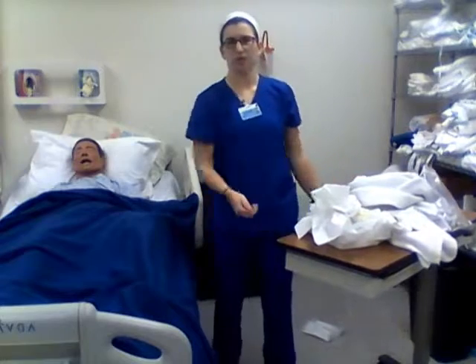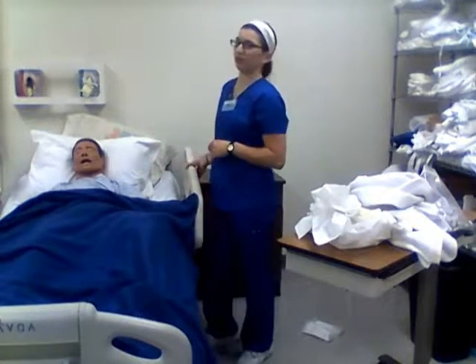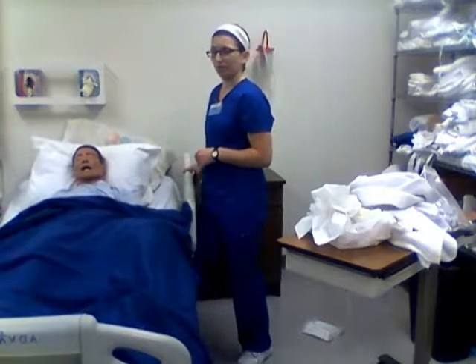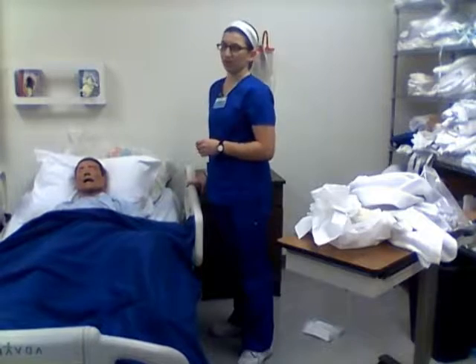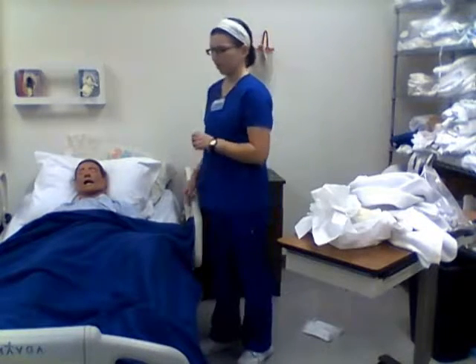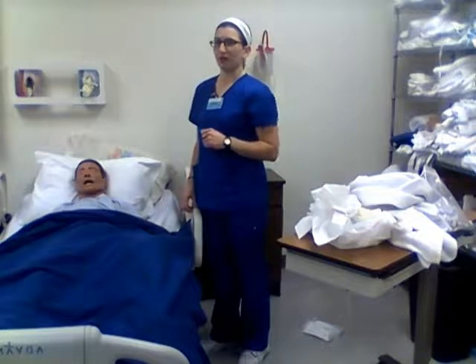And so before I leave the room, I'm going to provide any safety. So I'm going to lower her bed back down to the ground again. I'm going to bump the bed, make sure that it's locked. I'm going to make sure that her call light is in reach and that she knows how to use it and to actually use it if there's anything that could go wrong. I'm going to open up her curtain again. I can bring back her personal items.